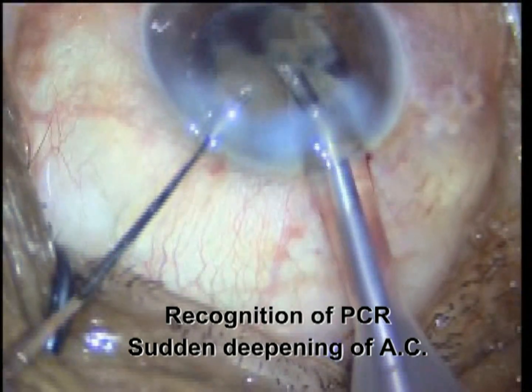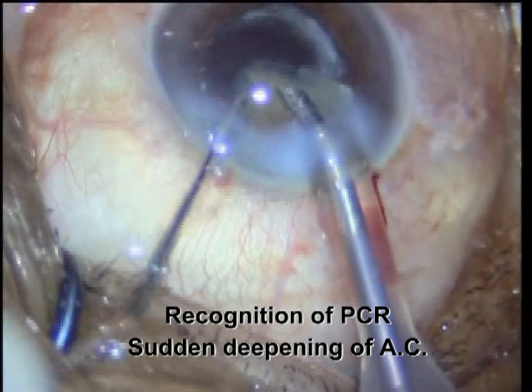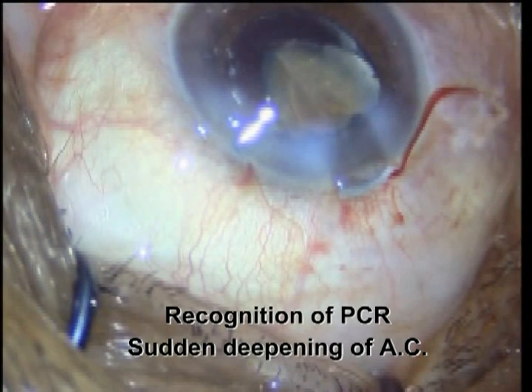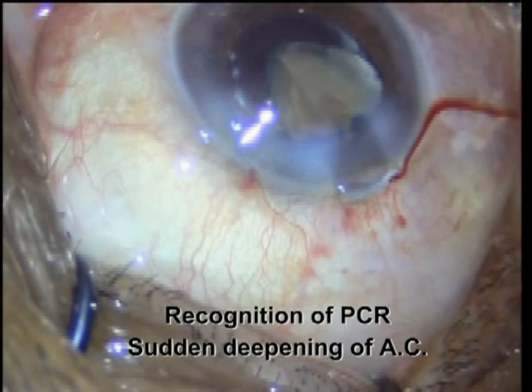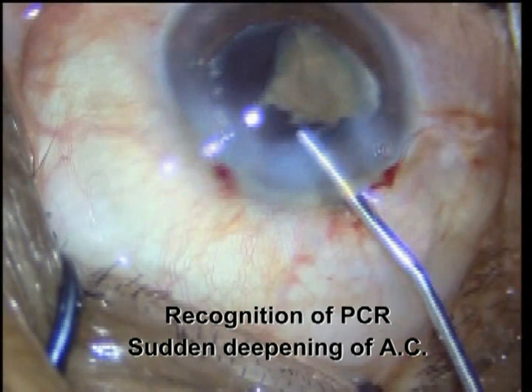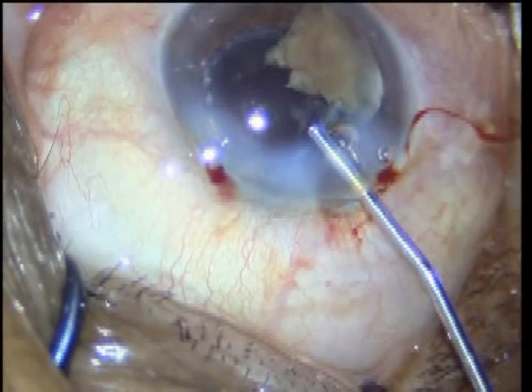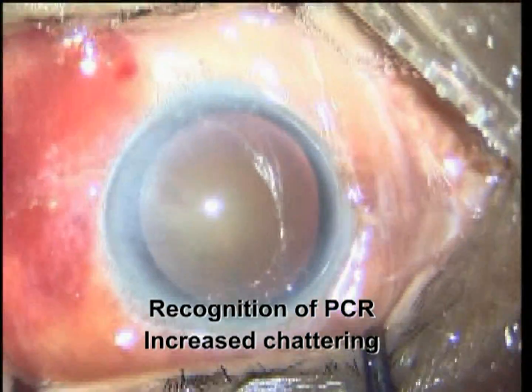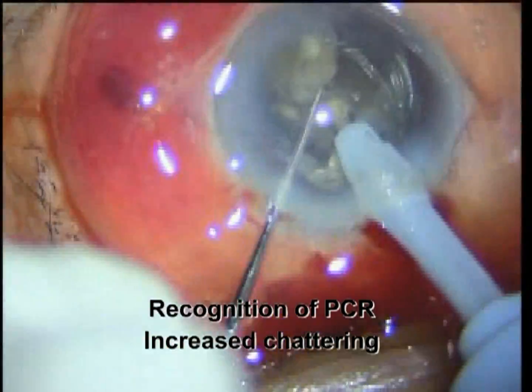In this case, during phacoemulsification there was sudden deepening of the anterior chamber, and it was found that there was PCR. Sudden deepening of the chamber is a sign of PCR.